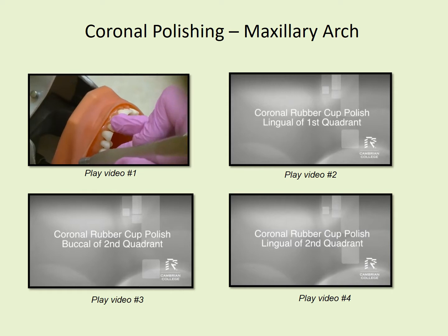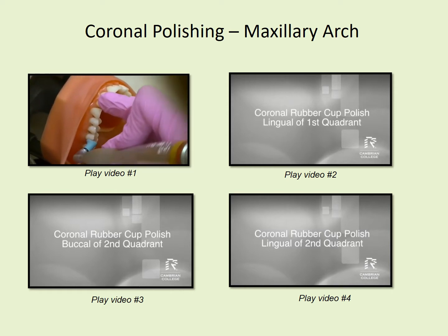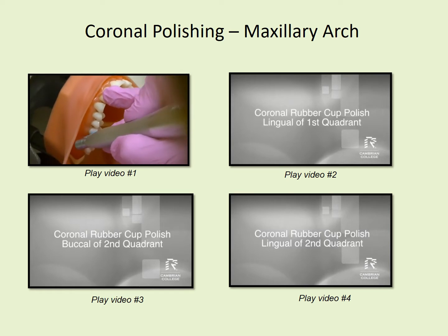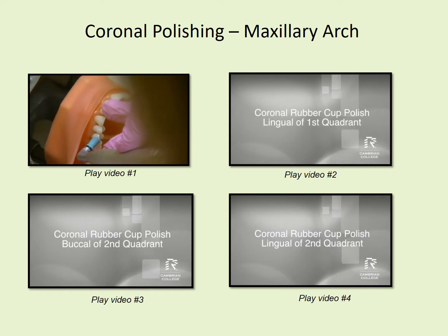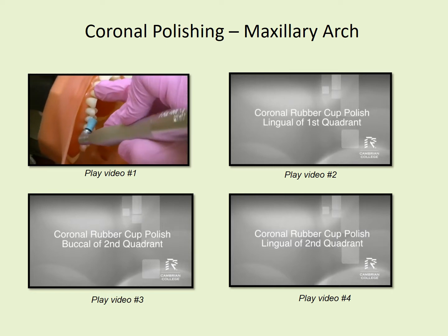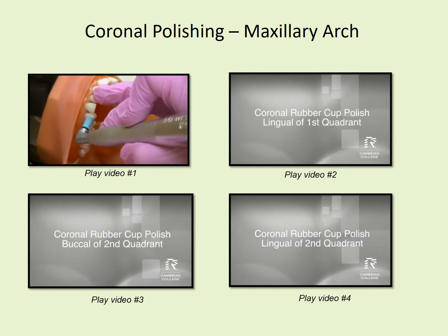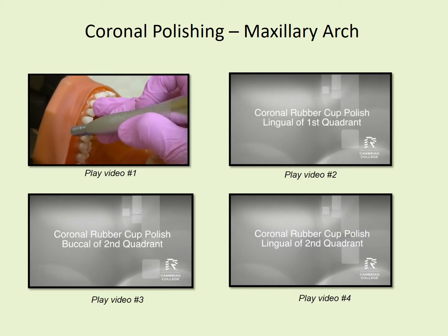Again, you're flaring the cup only on the gingival third. Pat, pull, pat, pull. Up to and including both premolars.